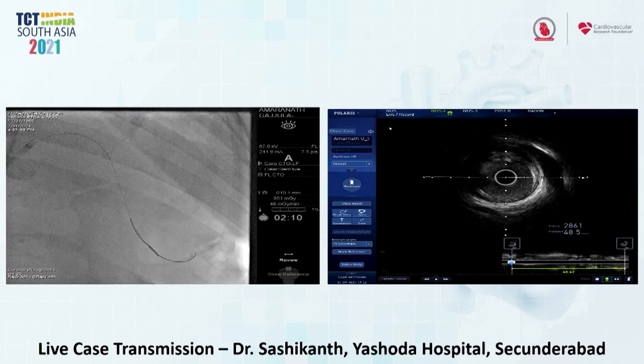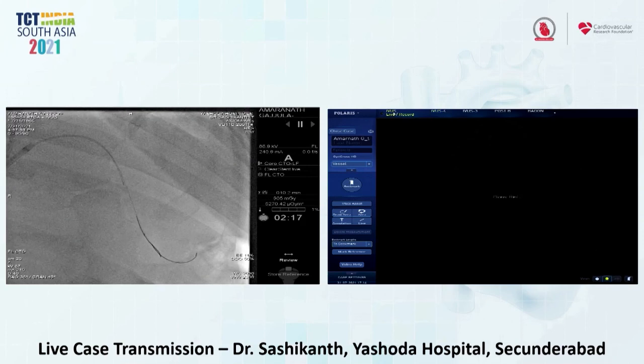Can you see the images? Any suggestions from Dr. Frank, Dr. Ajay Kirtane? From my point, yeah, go ahead.